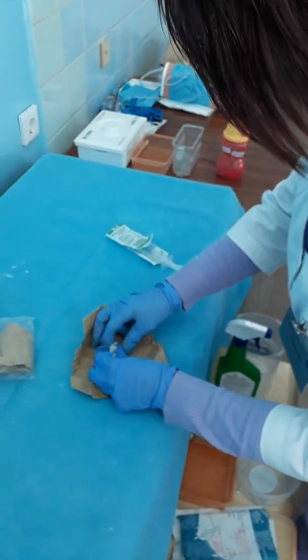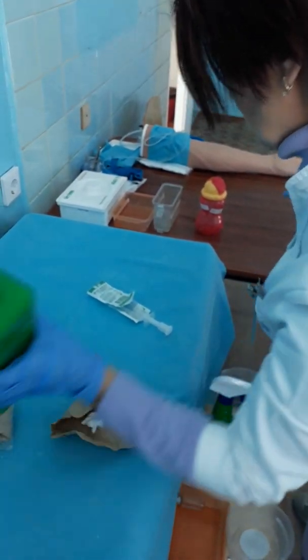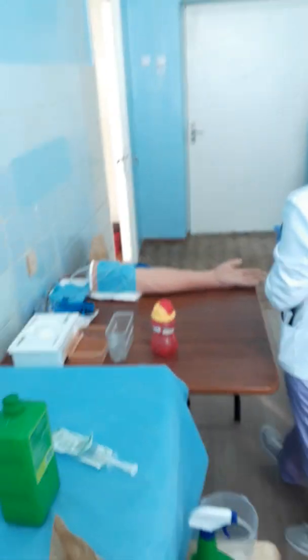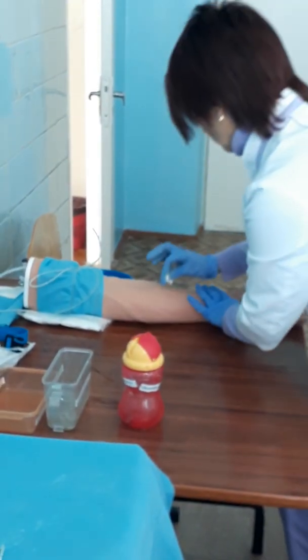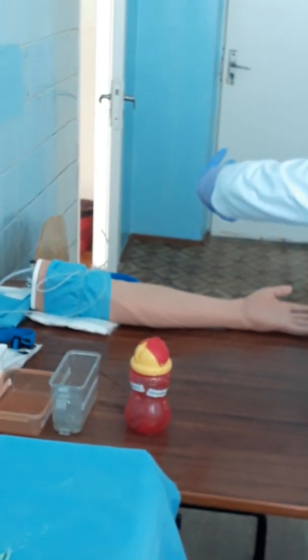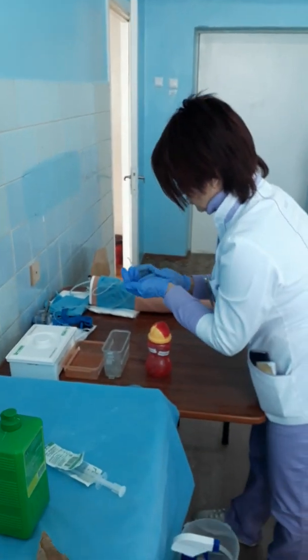You prepare a wet sterile swab, wet with special solution for skin, and pay attention, for intravenous infusion, you clean 10 by 10 and 5 by 5, but all the time you move it, it must be proximally, upper, yes. You clean in this position.